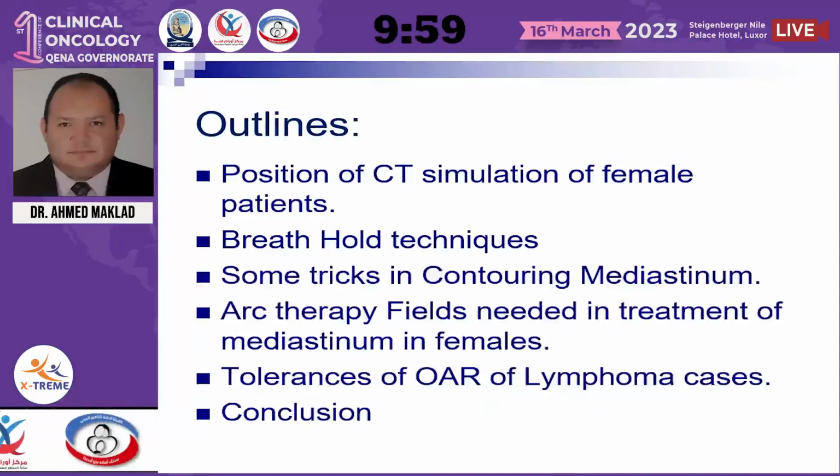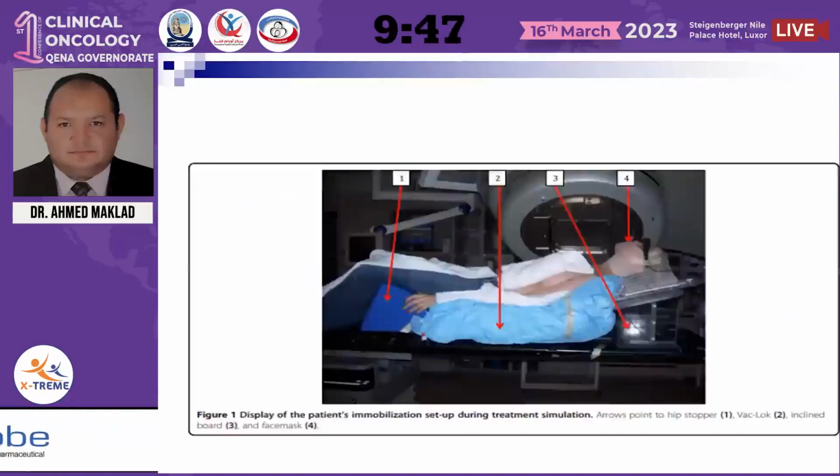The third point will be some tricks in contouring the mediastinum. The fourth will be the arc therapy fields needed in treatment of the mediastinum in females. And lastly will be the tolerances of organs at risk in lymphoma cases.